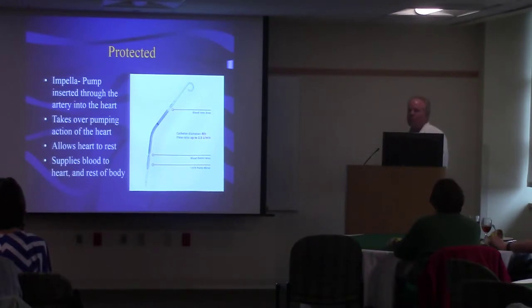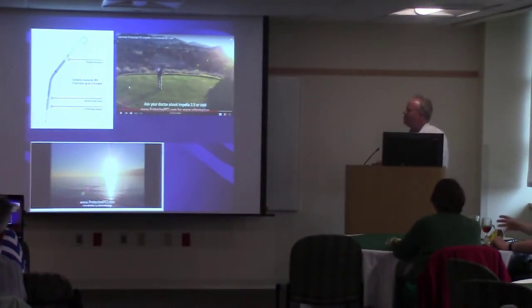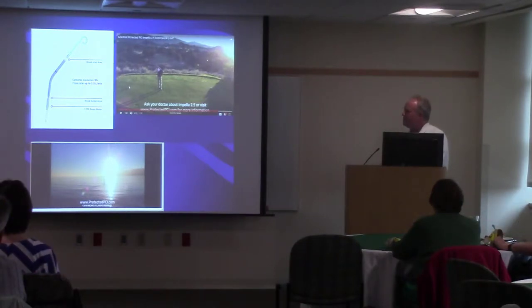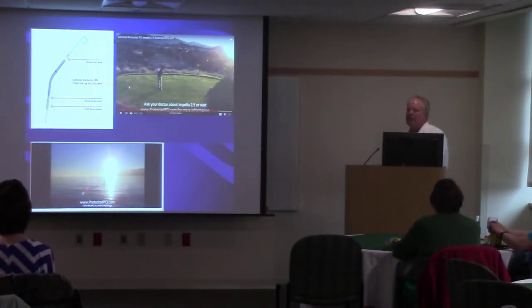And it also supplies blood to the body and to the heart itself while we're doing the procedure, which allows us to work on the heart itself. You've probably seen commercials for this device on television. It shows folks living great lives, playing golf, and sailing away into the sunset. This isn't just a marketing blitz. This is actually what we do in the cath lab, and this is what we aim for, is to get people back to fully functional lives and able to do the things that they enjoy.